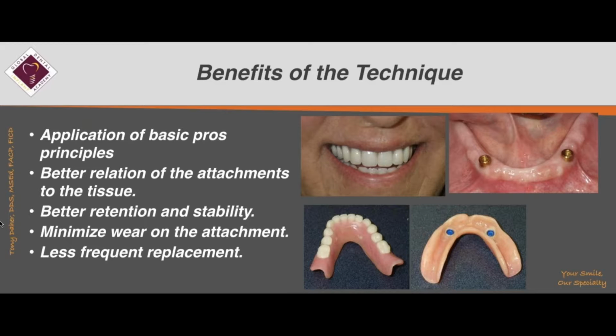So that patient I showed you without implant certainly should be able to eat most of the food, but she's going to be away from sticky food. To be able to eat anything they want, certainly you have to improve the retention on these dentures. I hope it's clear for you guys.